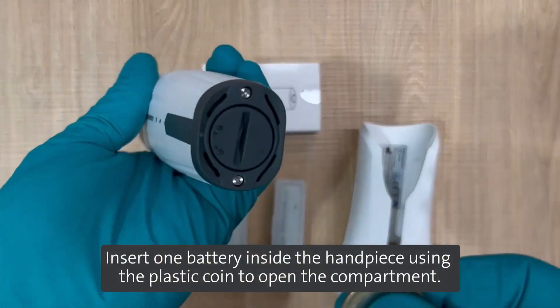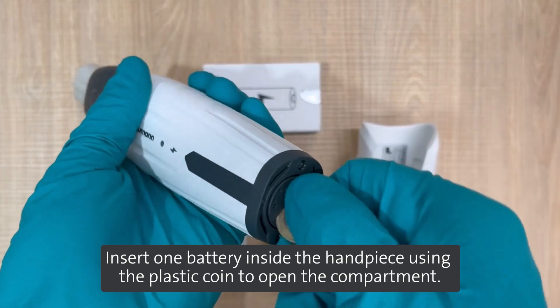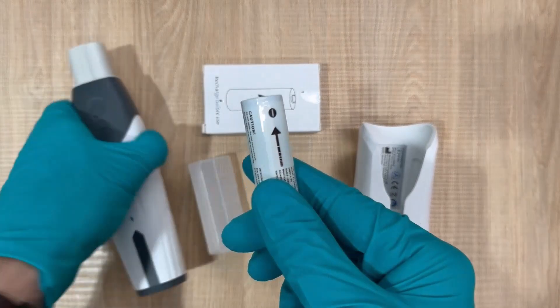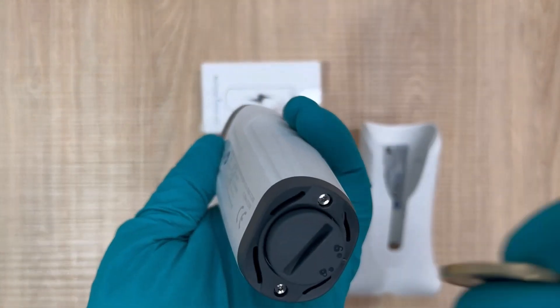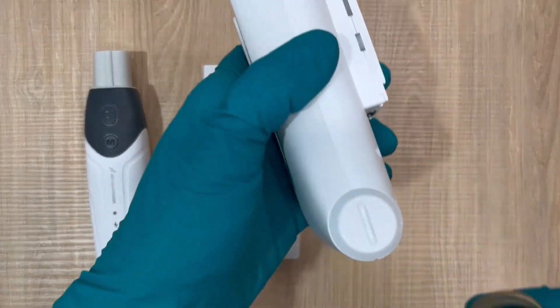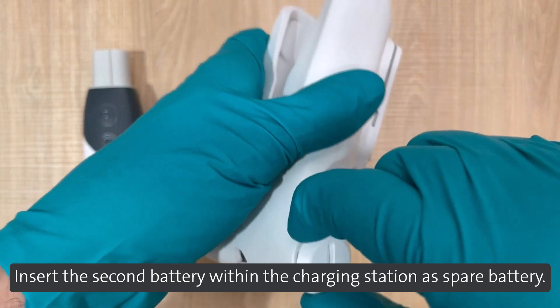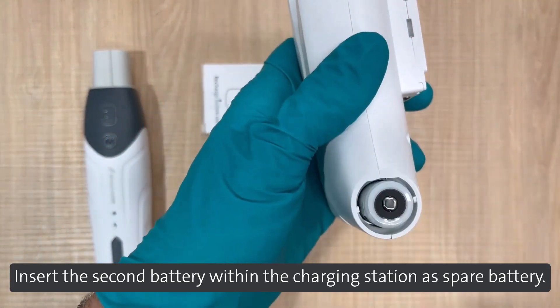Insert one battery inside the handpiece using the plastic coin to open the compartment. Insert the second battery within the charging station as a spare battery.